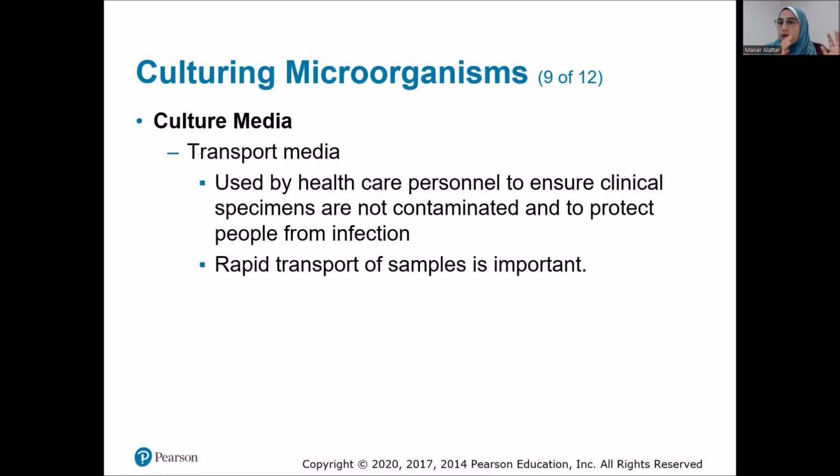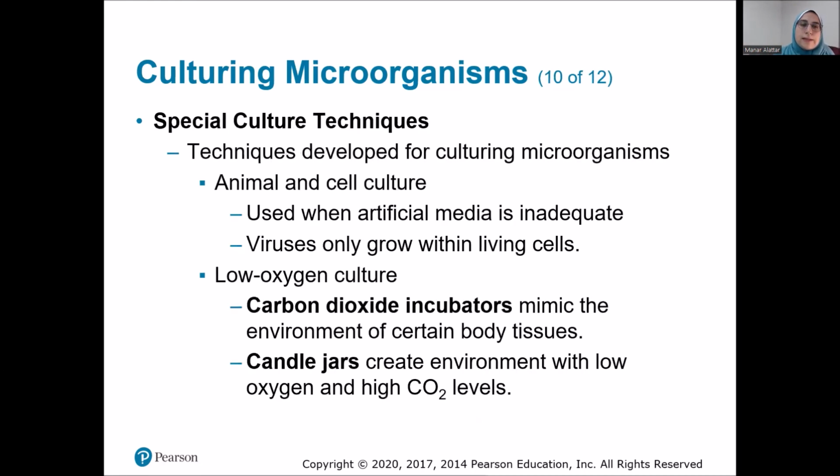Because sometimes you collect the sample and then it takes 24 hours or 48 hours before it gets to the lab, and then these other types of tests that we talked about can actually be started. And so you need all of those different organisms within that sample to remain viable, so the pathogen, whichever one it is, is still present once the tests are actually started. And so that's what transport media is. Okay.